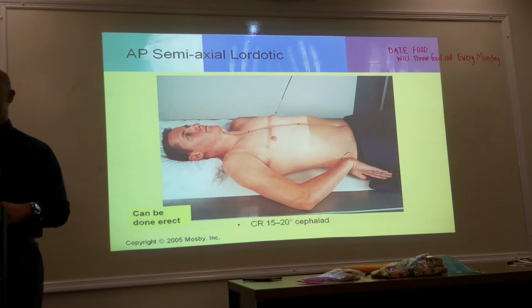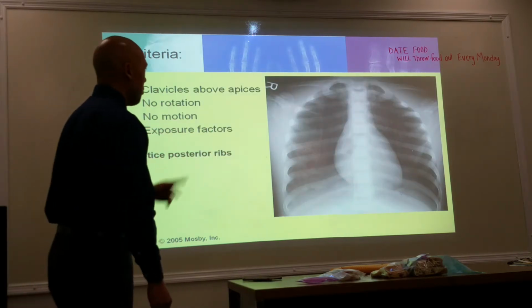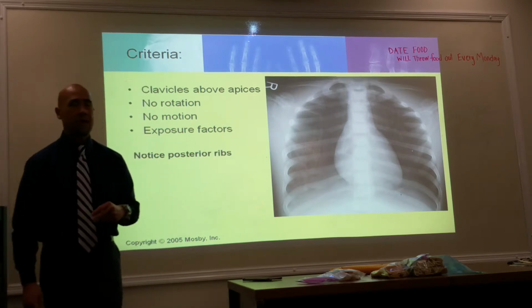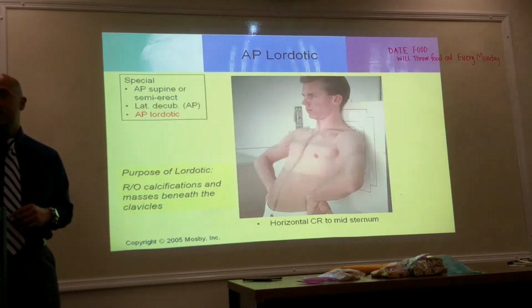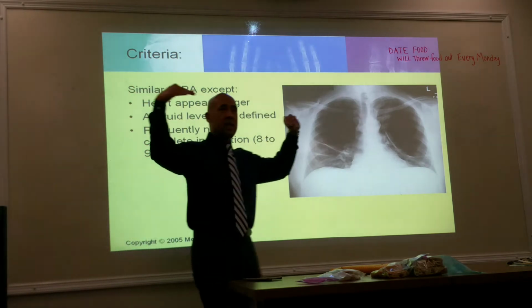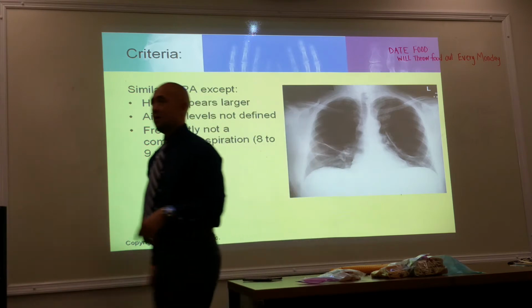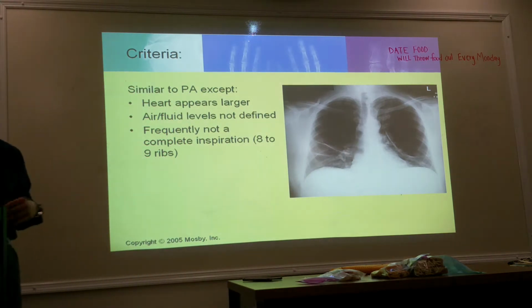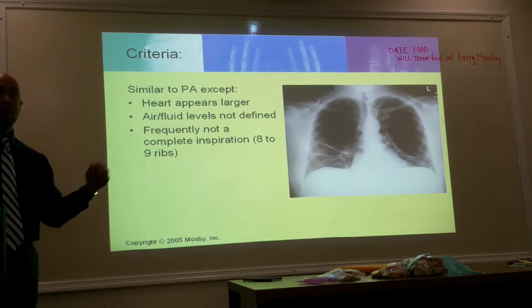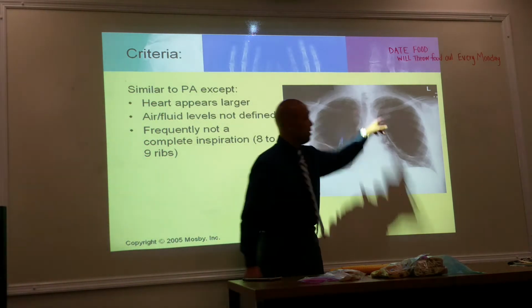All right, any questions? Okay, so here we have a chest x-ray. Most chest x-rays you will see that the clavicle comes down at an angle like this, which places you at the level of about T2, T3, or T4, where the SC joint is located. This is about T3, T4.